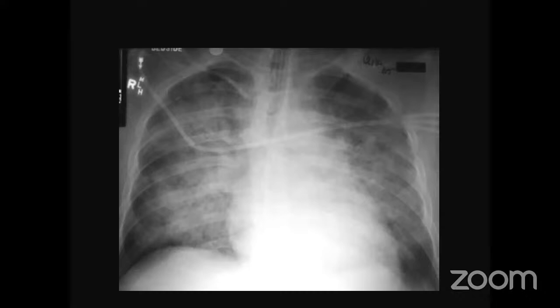The other common problem that we often have is we see a lesion on the X-ray. It looks like consolidation. We don't know if there's an underlying mass or a mass around that. So that's another one. You say wait for 6 weeks, repeat the X-ray, see if it's not responding, get a CT done. I'm sure most of the oncologists will say you can't wait for 6 weeks because there's a mass.